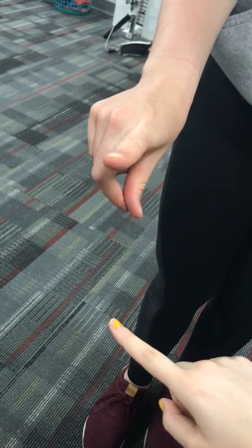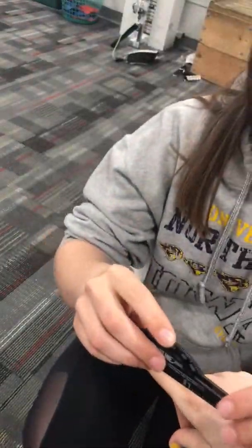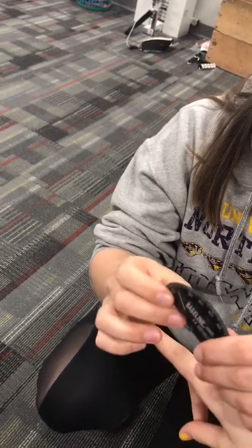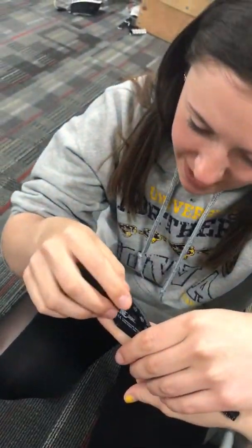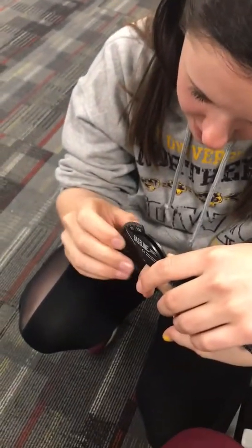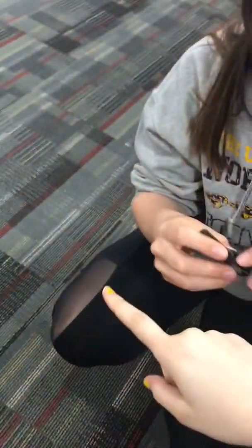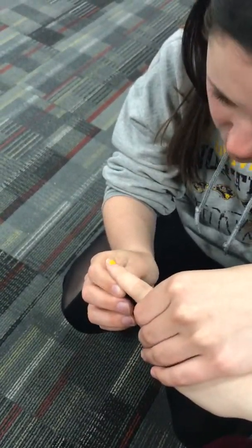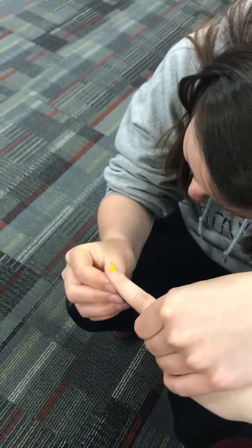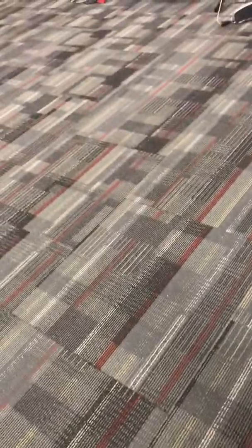Next, active finger flexion and extension. Have the patient demonstrate with the pointer finger — extend and flex. For flexion, place the goniometer over the joint line and have them flex; she's at about 70 degrees. For extension, place it underneath and have them extend; she's at almost exactly zero. For this one, compare bilaterally to the same finger on the other hand.